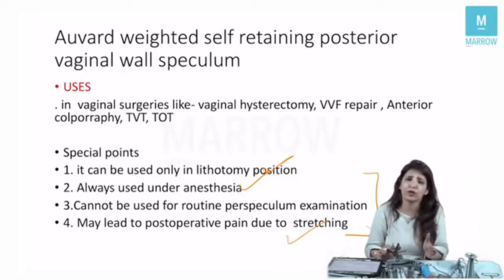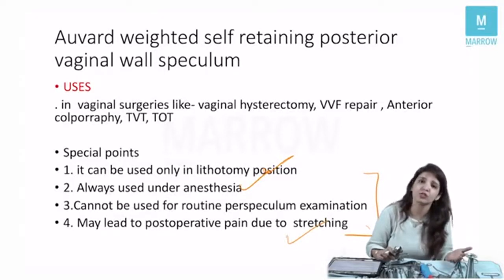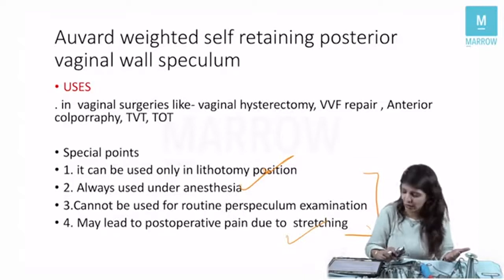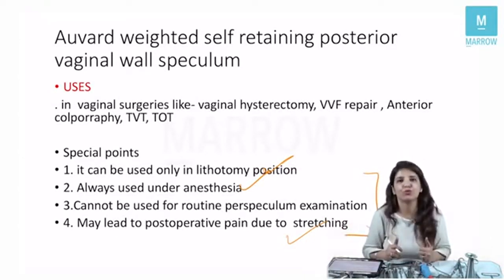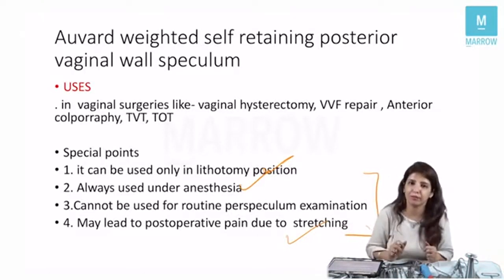So when you are doing a vaginal hysterectomy, or you are doing TVTs, that is the tension-free transvaginal obturator tape, tension-free transvaginal tapes, or you are doing anterior colporrhaphy, in all these surgeries, you are going to use Auvard's self-retaining speculum, right?